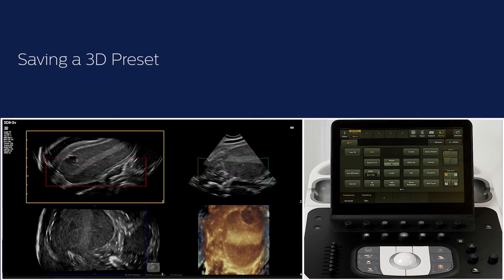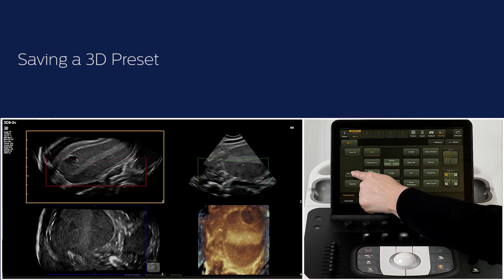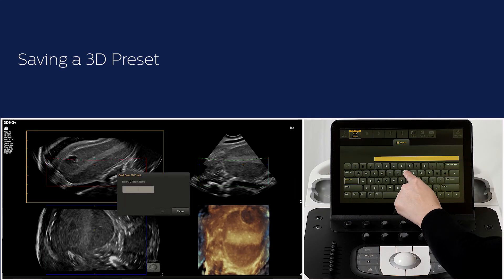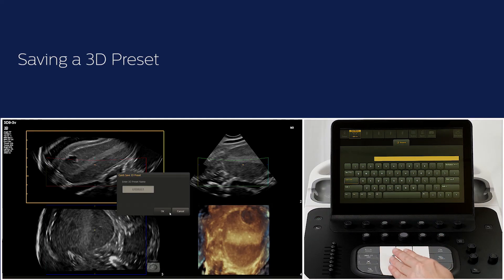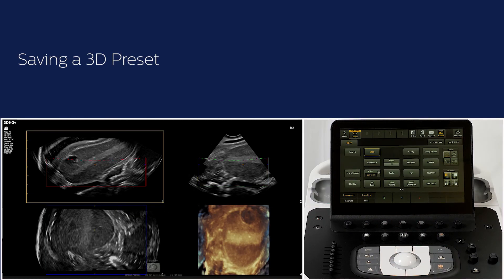For 3D and 4D acquisitions, different settings are needed depending on the anatomy that you are looking at. After you have optimized your data set and volume image, you can save your settings — which include multiple 3D and 4D parameters — by pressing Save 3D Preset on the touch screen. Provide a name for your preset and you can directly use it in the future with all your settings saved, for example for an acquisition of the uterus or ovary.